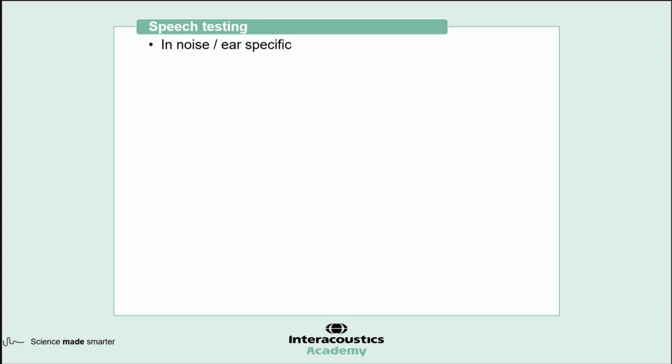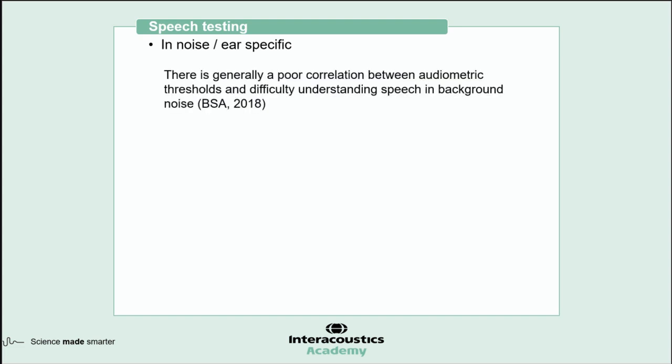The reason behind performing speech testing is quite nicely demonstrated by this statement from the British Society of Audiology, which is that we know there really is a poor correlation between the audiogram and our actual difficulty understanding speech in background noise in particular. We're not really able to extrapolate one from the other. So we do need to perform speech testing to establish again for each individual what the situation looks like. There are some considerations for speech testing.